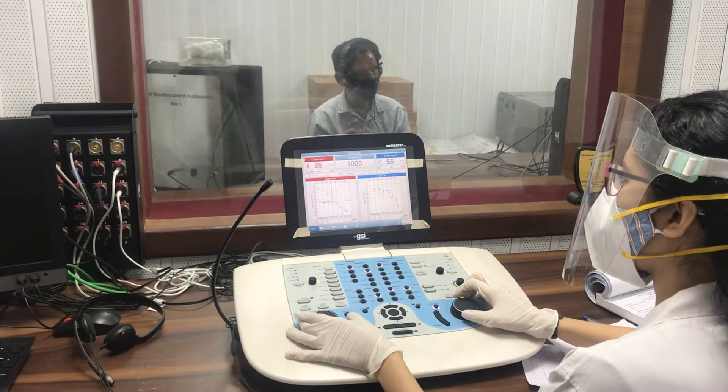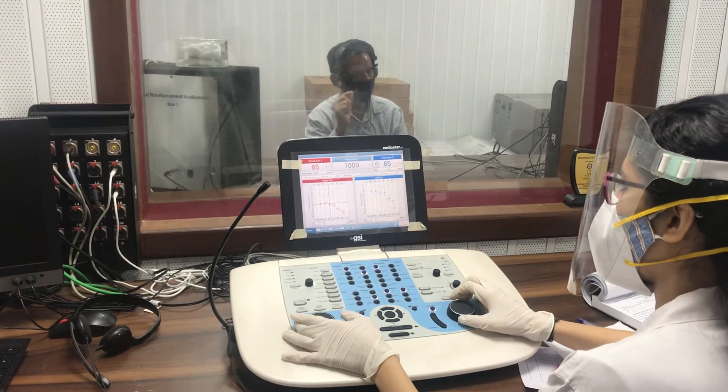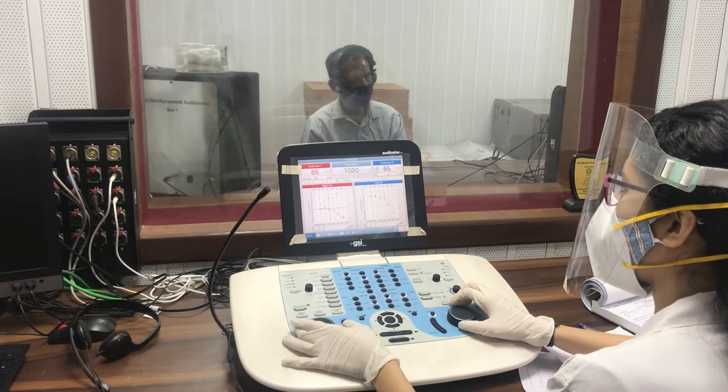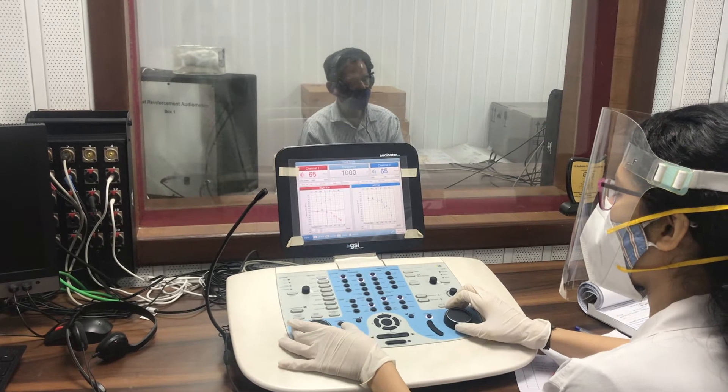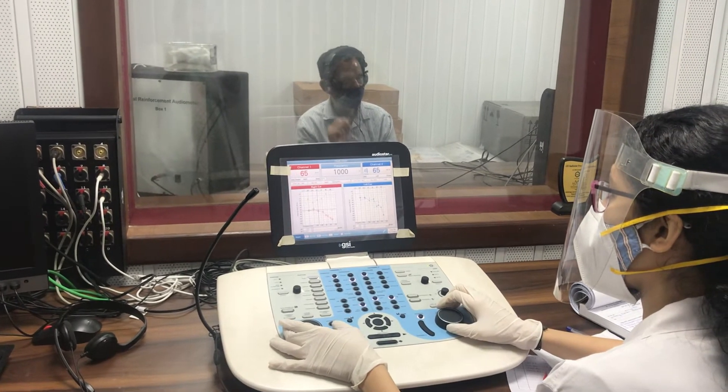There would be a noise which may change in intensity, and the patient does not have to respond to the noise — only to the tone presented through the BC vibrator.